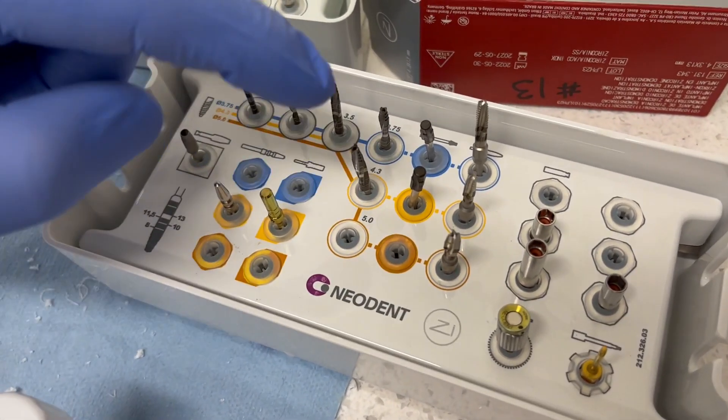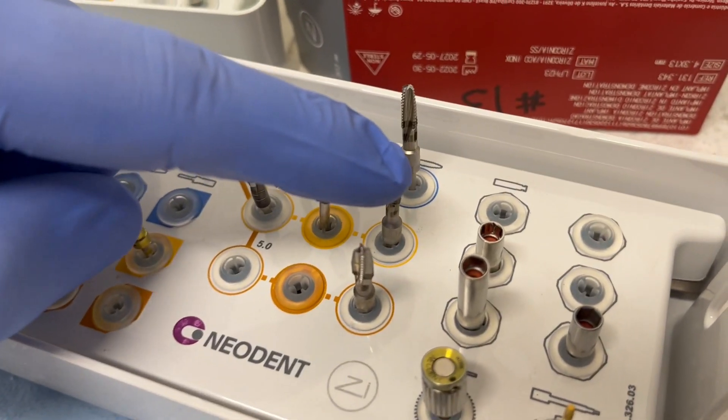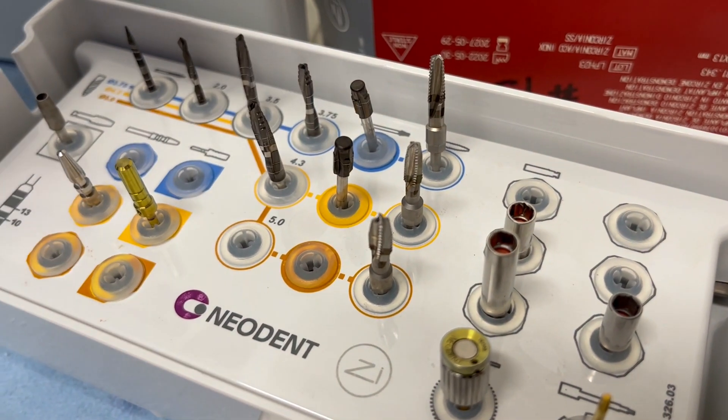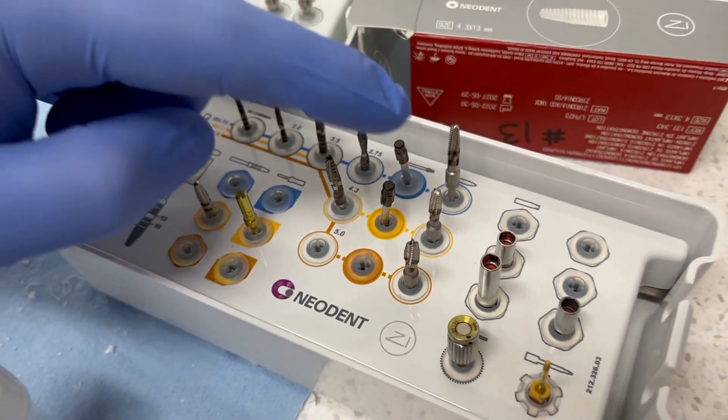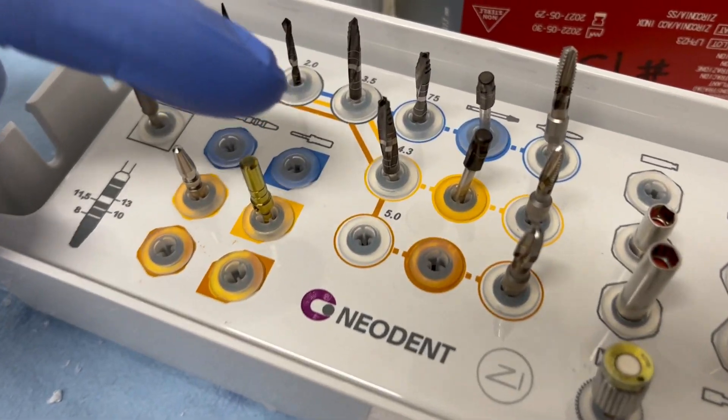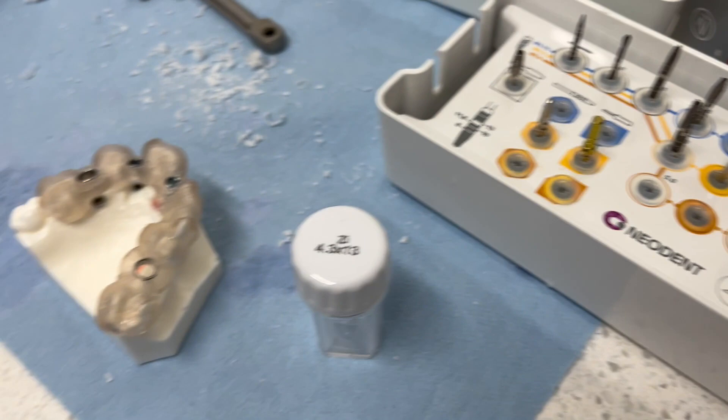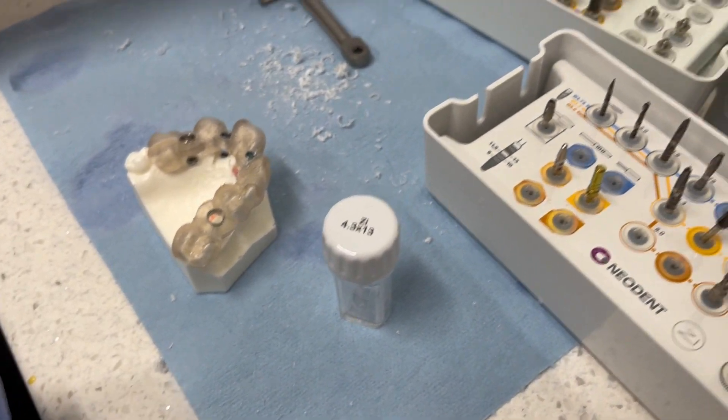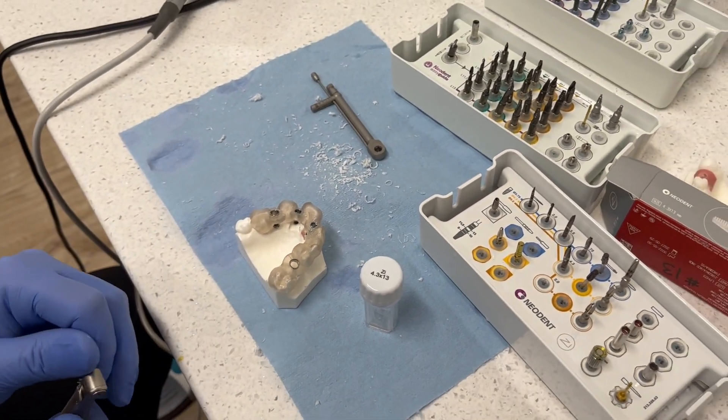In that case, we have to use this countersink tool and we have to tap the bone if we're in D1 or D2. If we're in D3, we have to do a countersink only. And if we're in D4, we just go to the corresponding drill size. So now there's no full digital workflow, but we're able to still utilize it to be able to get our implant in the ideal prosthetic position.